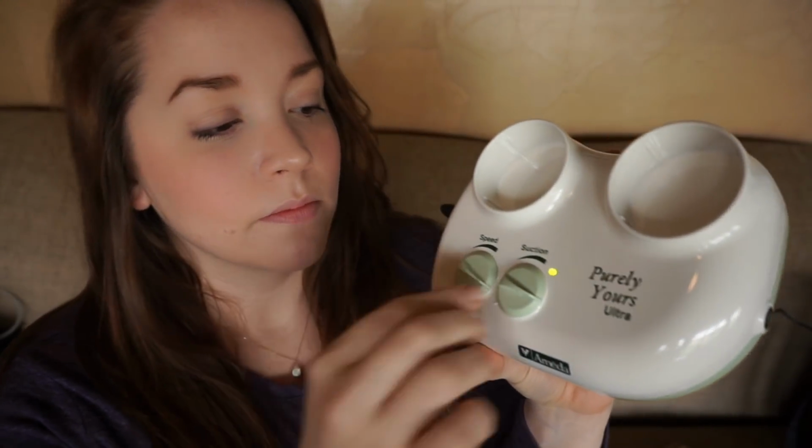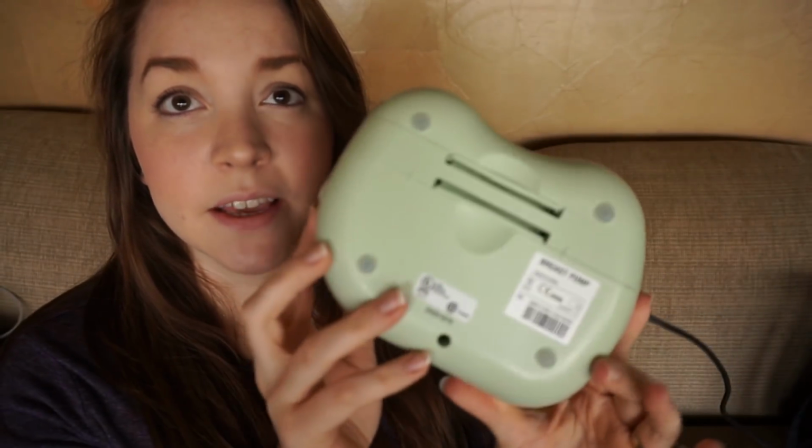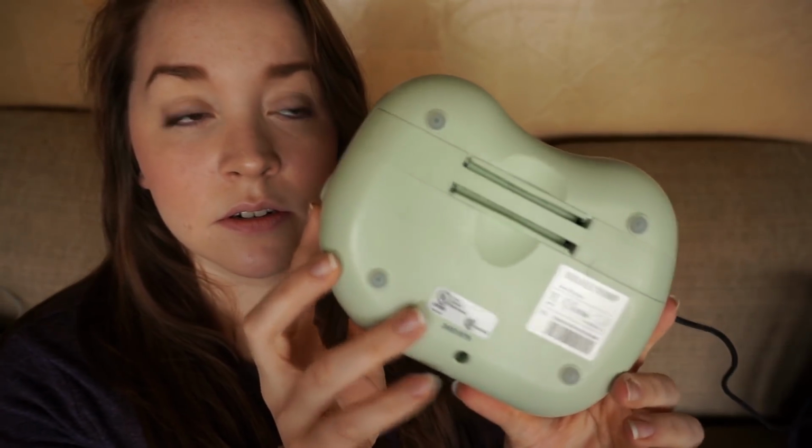During the video, I couldn't for the life of me figure out why it wasn't working with the wall adapter, and it's because I was putting it in the tubing port. So I figured it out. Here we are. So this is what it sounds like. And I do have the speed and the suction turned all the way up. So this is what it sounds like. So yeah, like I said, it is pretty loud. Yeah, that's what it sounds like.